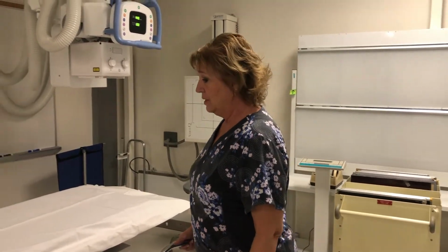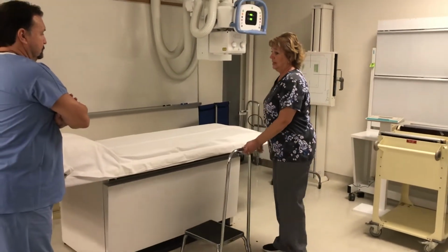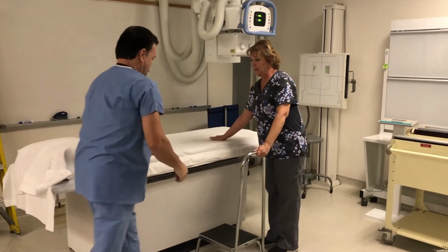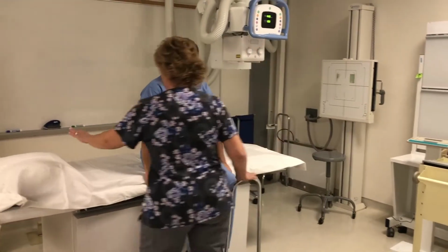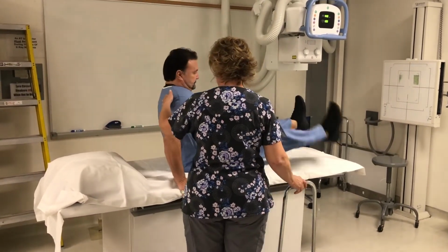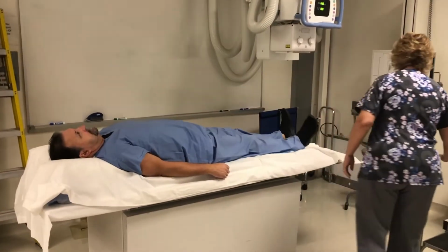So first of all, we're going to have our patient lay down in the supine position with his head to my left. So, Mr. Curtis, would you sit down here on the edge first? And then I'd like you to lay on your back with your head toward the pillow and your feet toward that end. Okay, thank you.